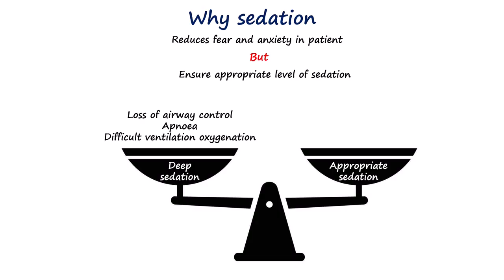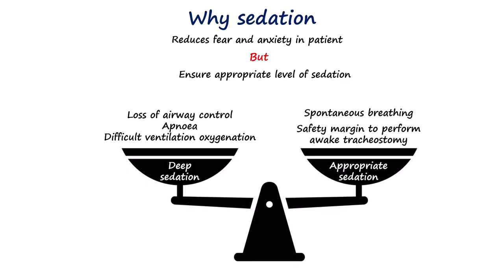By keeping the patient spontaneously breathing, we give ourselves a safety margin. It means that if the fiberoptic attempt doesn't work, we can pause, step back, and consider another option, like an awake tracheostomy, without losing control of the situation.